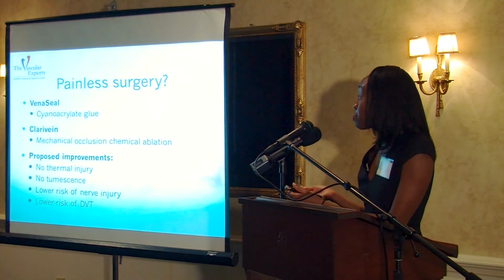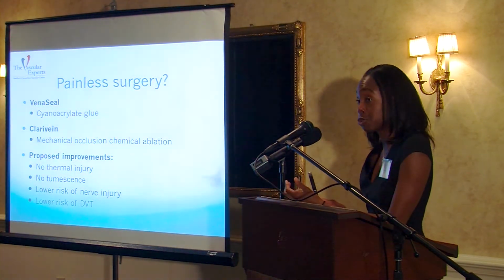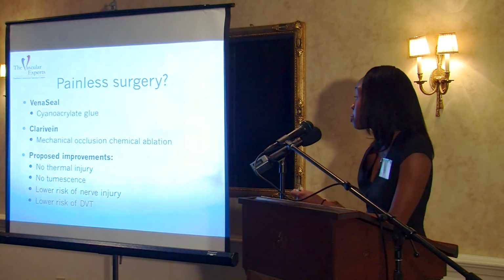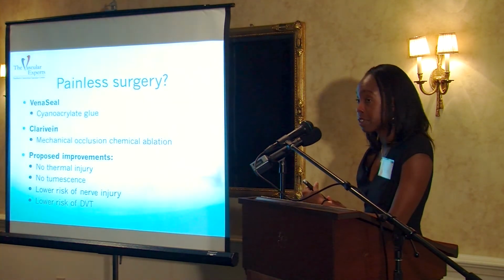So again, the proposed improvements of these techniques are that it's no thermal injury because these treatments are non-thermal. There's no tumescence, and that tends to be the least comfortable part of the procedure for patients. There's a lower risk of nerve injury and a lower risk of DVT.